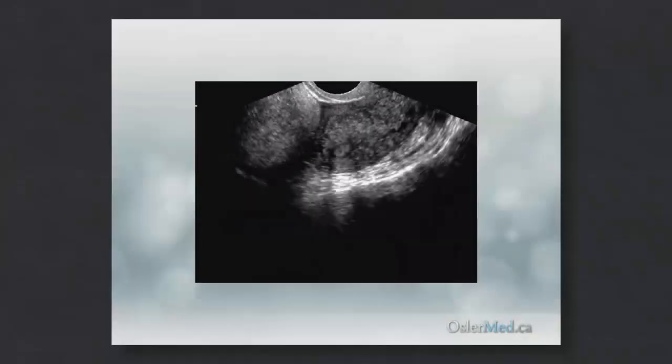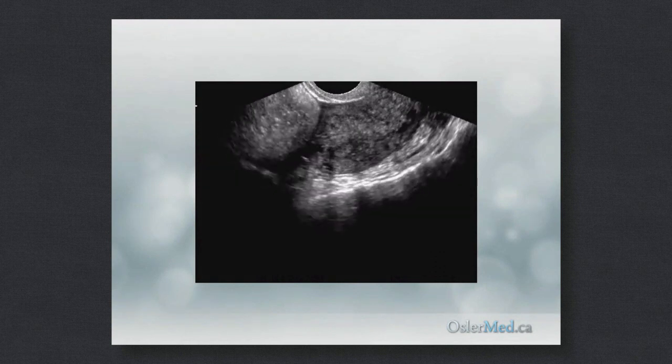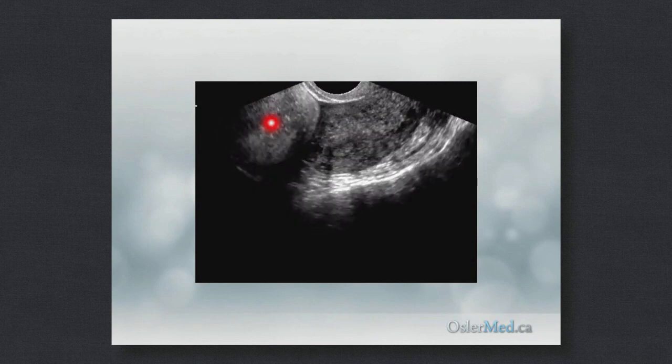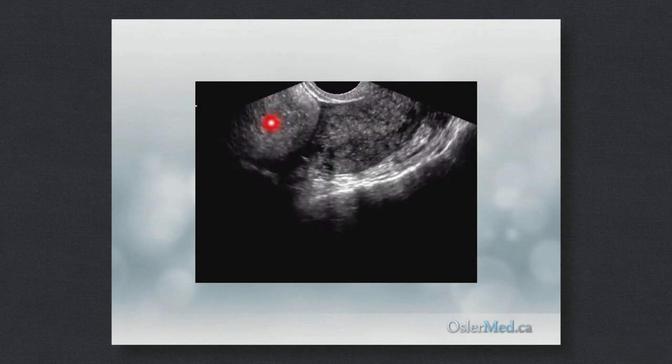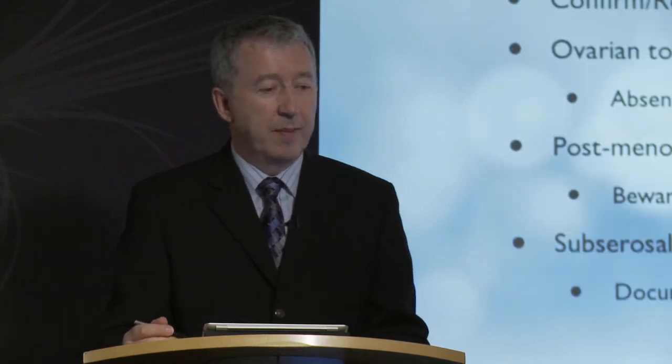information. A variant on this technique is keeping the endovaginal probe static and then palpating this large echogenic adnexal mass with the free suprapubic scan. And when doing this, we can see that this mass moves independent of the uterus, offering evidence that it's arising from a structure other than the uterus. And in this case, this was a large dermoid cyst or mature teratoma arising from the ovary. So this is a very helpful technique and will add additional useful information.